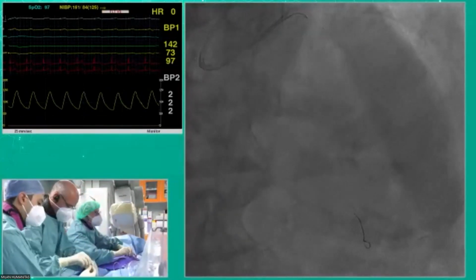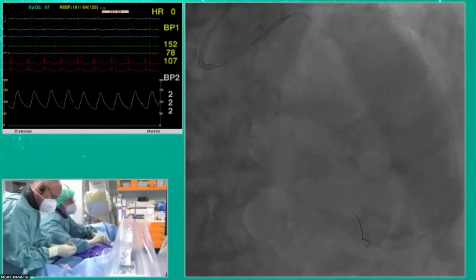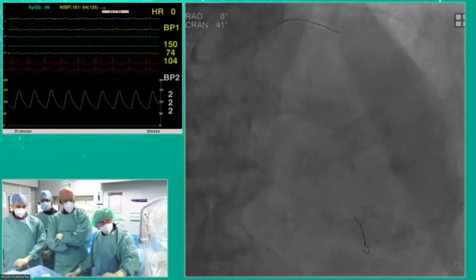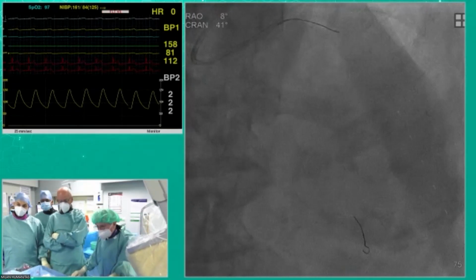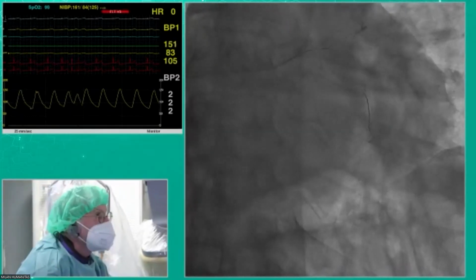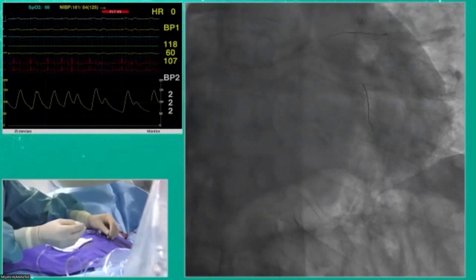Dr. Antonio, we just had a quick case in the previous session wherein we had to use a drug-eluting balloon in the distal LAD. But post balloon DEB, the result was very suboptimal, so we had to put in a stent. There was a question from the audience and from the panelists: a drug-eluting balloon followed by a drug-eluting stent, what would be the consequences on the vessel with the double dosing of the drug? Oh, we used to do it many years ago.